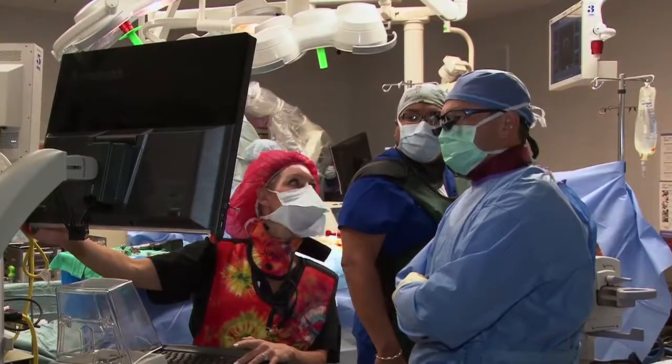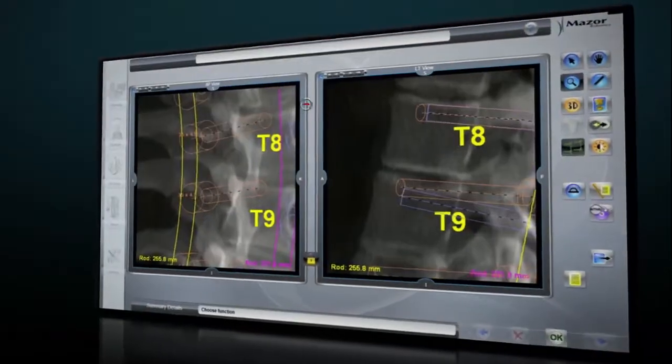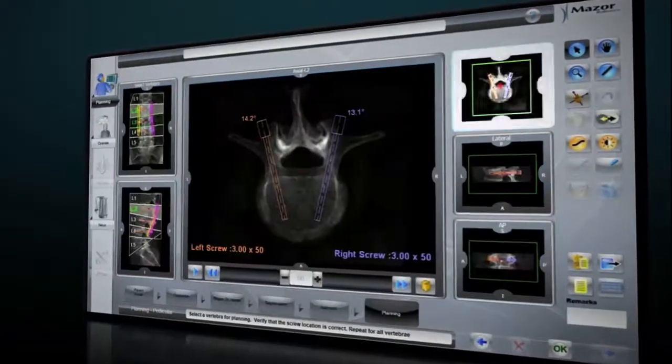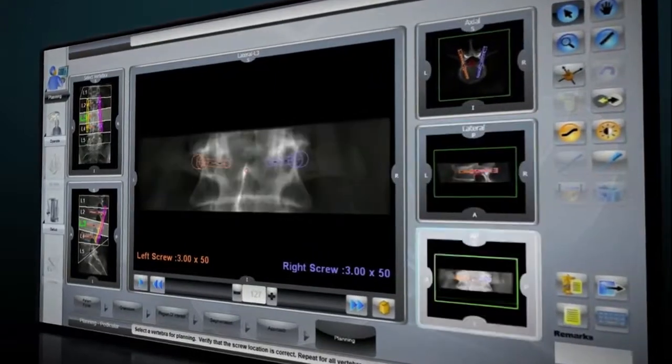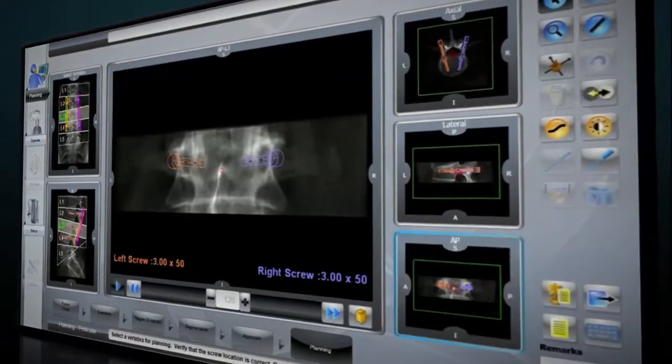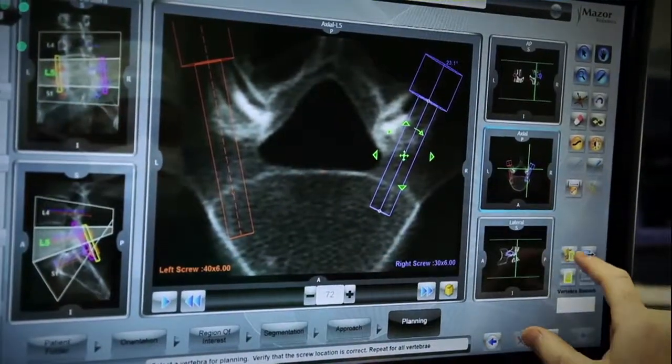Renaissance's interface allows the surgeon to review and modify this plan in axial, lateral, and AP views until fully satisfied with the location and purchase of the implants.